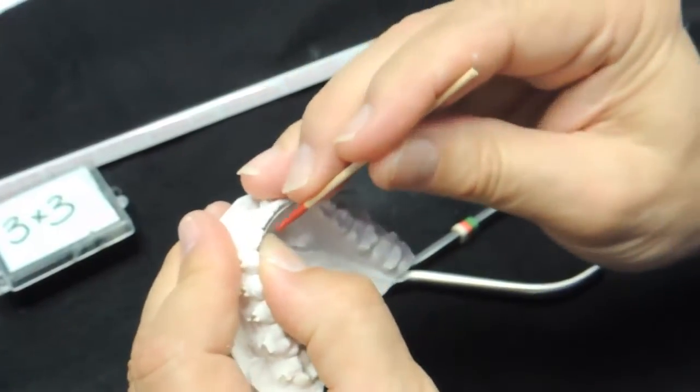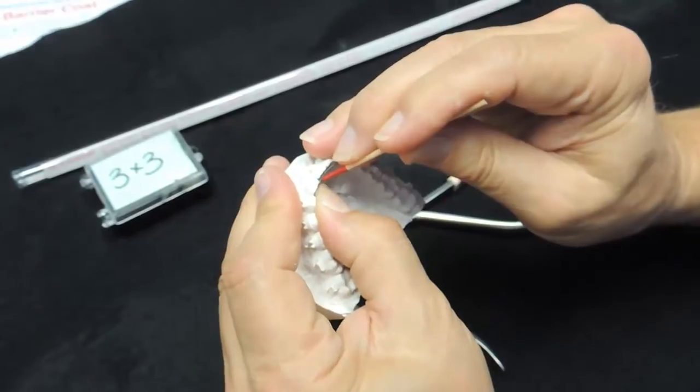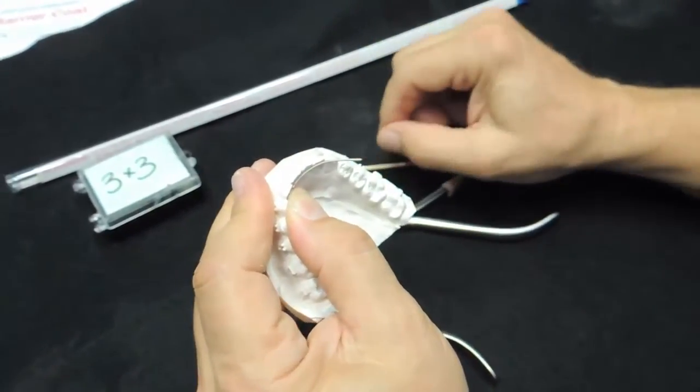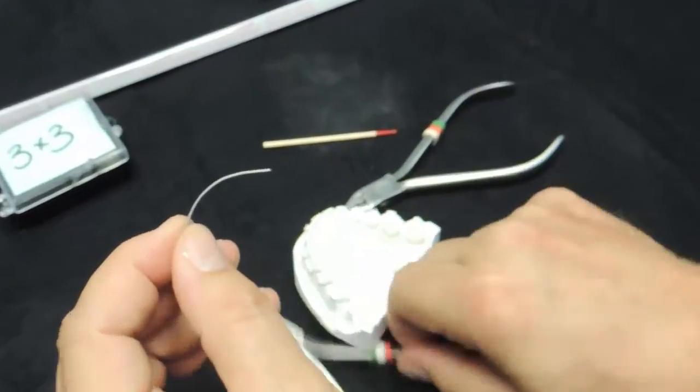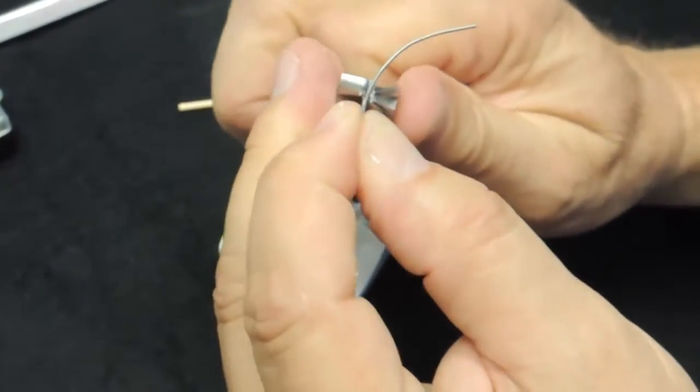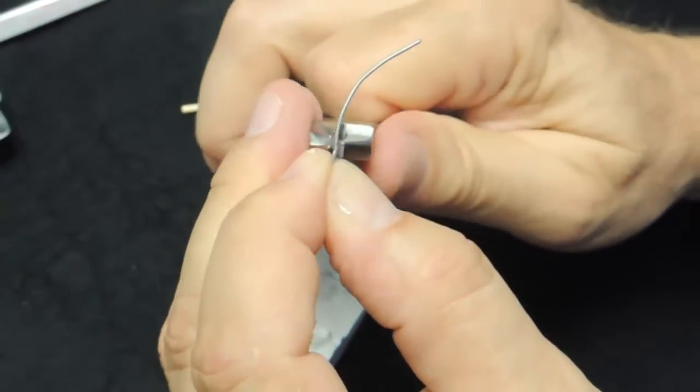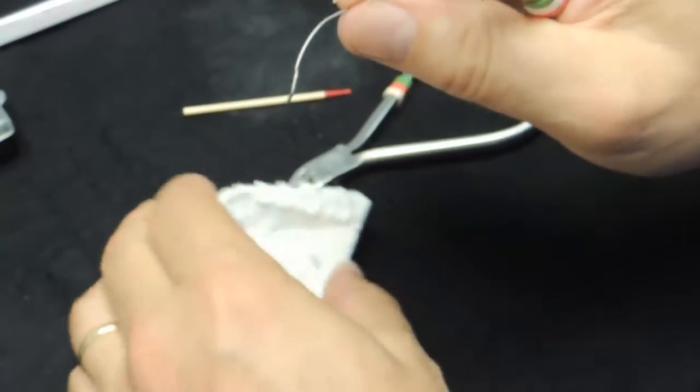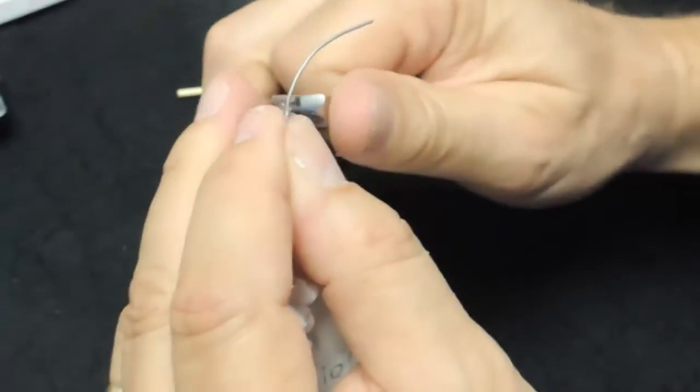Sometimes I need to make offset bends for the laterals. That doesn't happen all the time, but I'll make a mark where I need to make a little offset bend for the lateral, and I'll take a 3 beak and make a little bayonet type bend here in and out, just so it adapts better to the model.